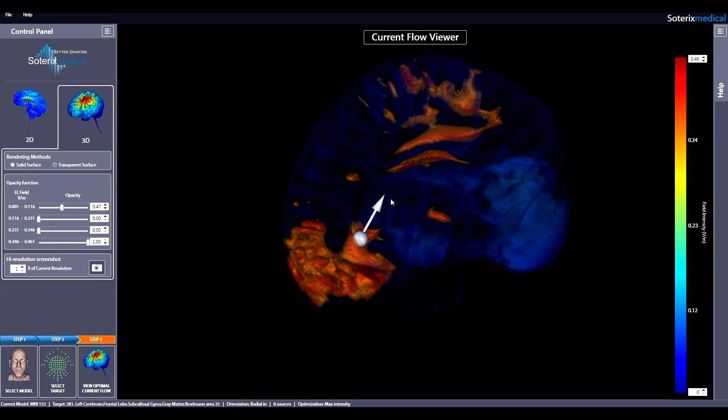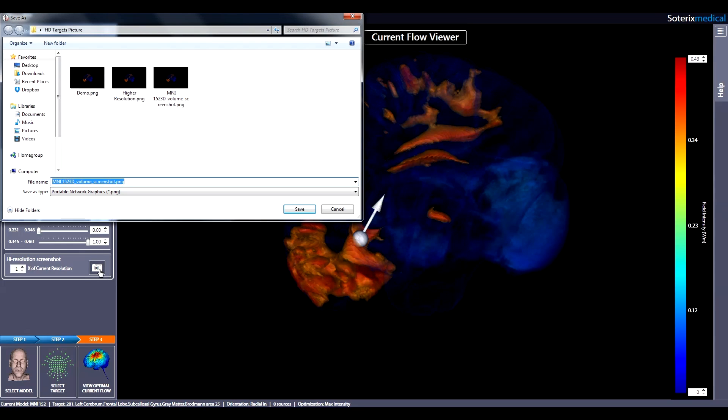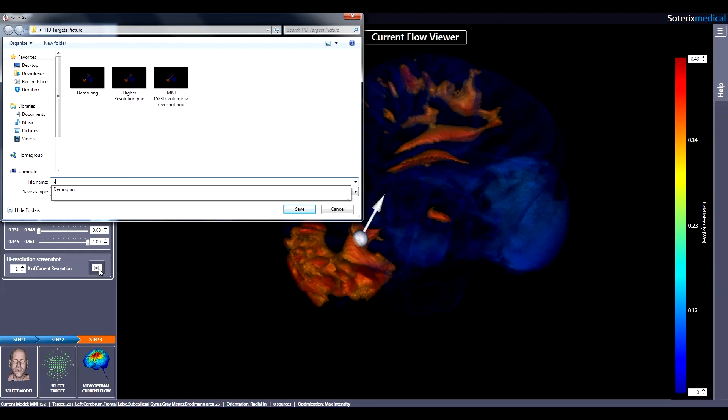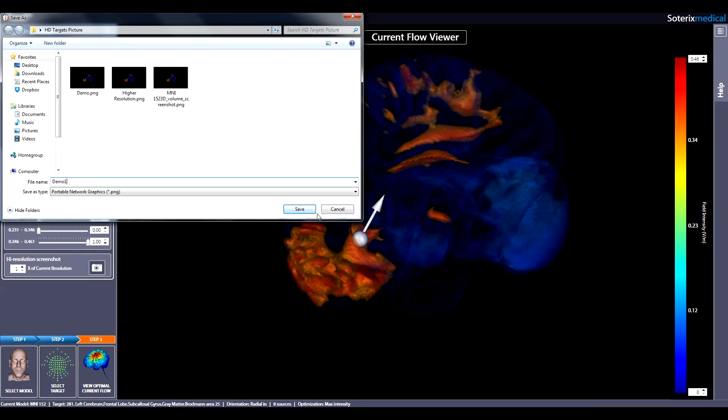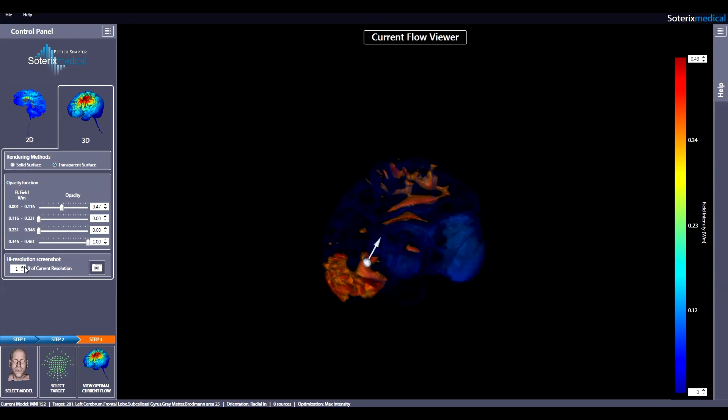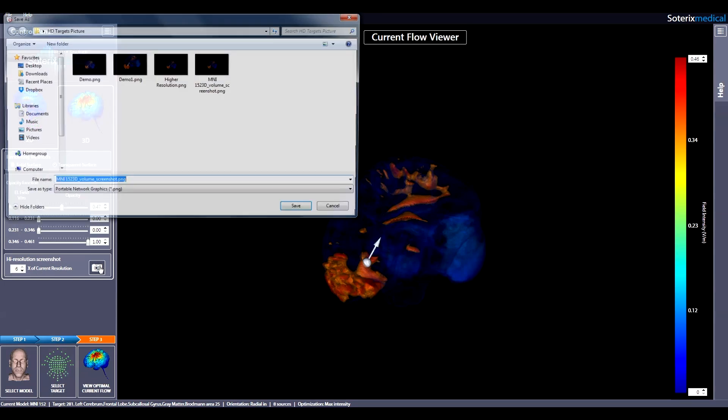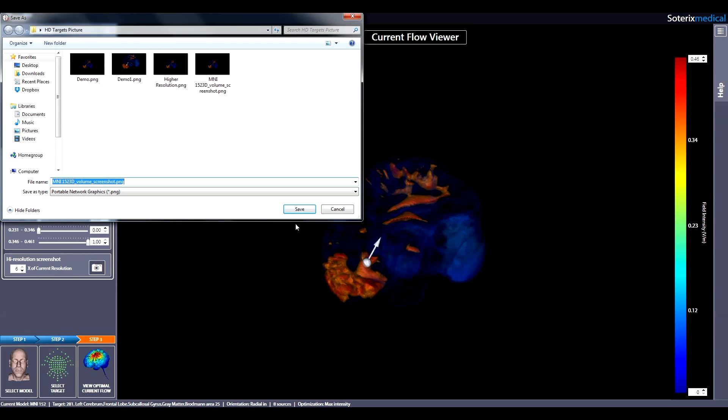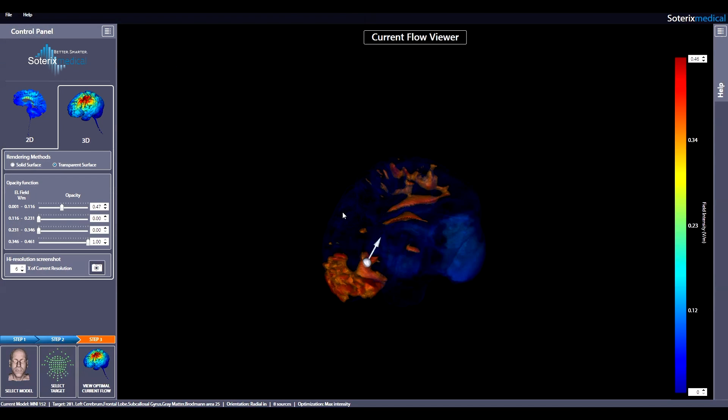If at any point you want to save what you are viewing, click on the camera icon and save your image. If you want a higher resolution image, you can increase the resolution up to 6 before saving the image. If you want to explore optimization for different targets, just repeat these steps.